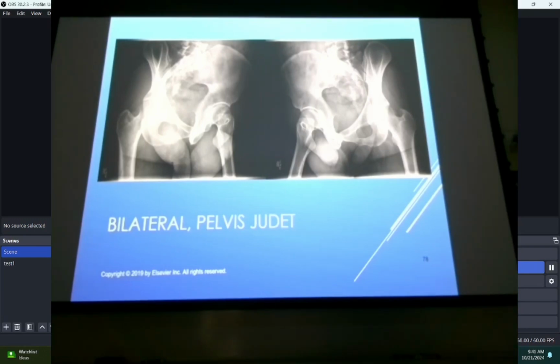Well, at the same level as symphysis pubis, you've got your greater trochanter. So if you can find the greater trochanter, again, you don't have to palpate the symphysis pubis. Also, it's going to be about 4 inches below the ASIS as well. And then if you look on page 415, you see the result of that angulation. You kind of see a frontal view of those anterior pelvic bones. That obturator foramen is much more open, right? It's not closed, it's more open. So that is the Taylor method, and that's the outlet projection.